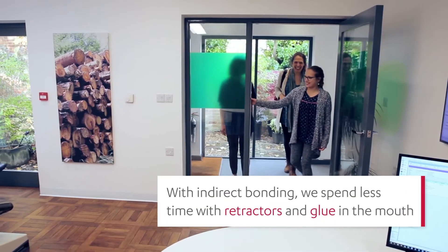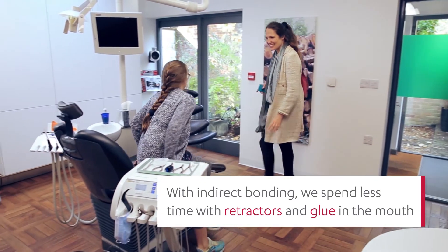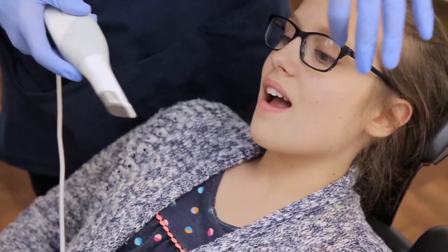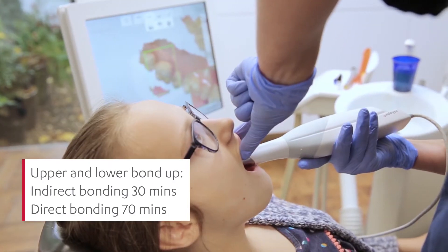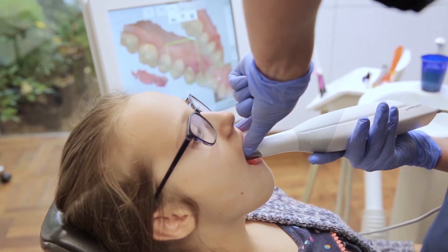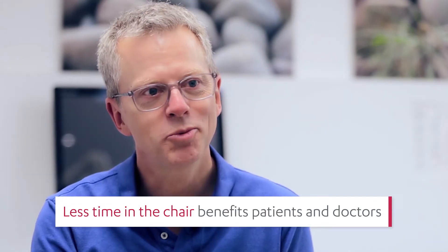The big advantage with indirect bonding is that we are spending less time with the retractors and the glue in the mouth. I schedule 30 minutes for an upper and lower bond-up when I do it indirectly, whereas on a manual setup I would normally spend 70 minutes. And that is to my benefit but also to the patient's benefit.